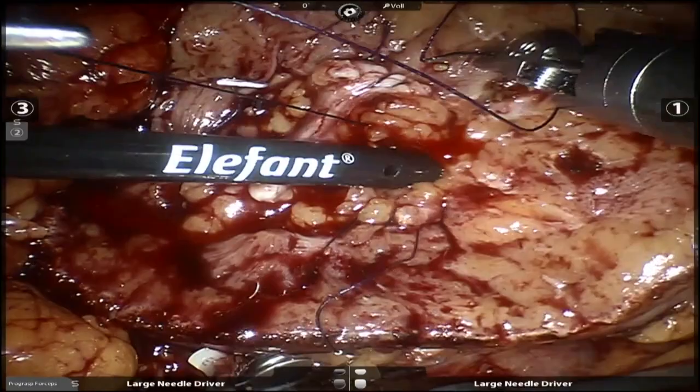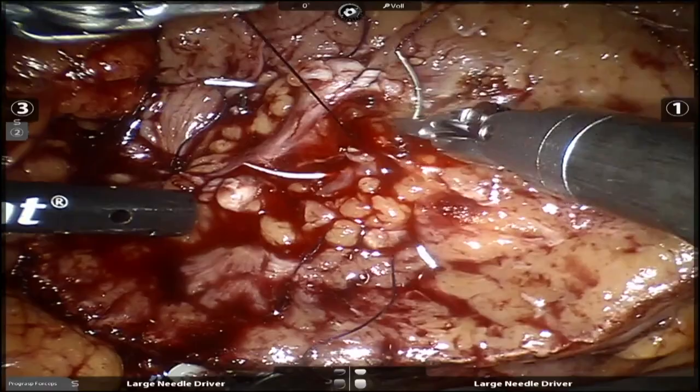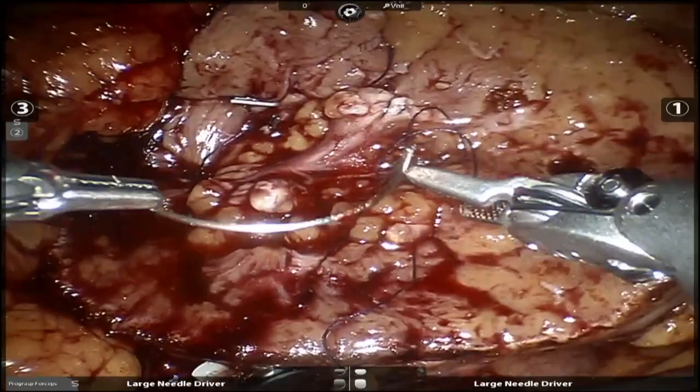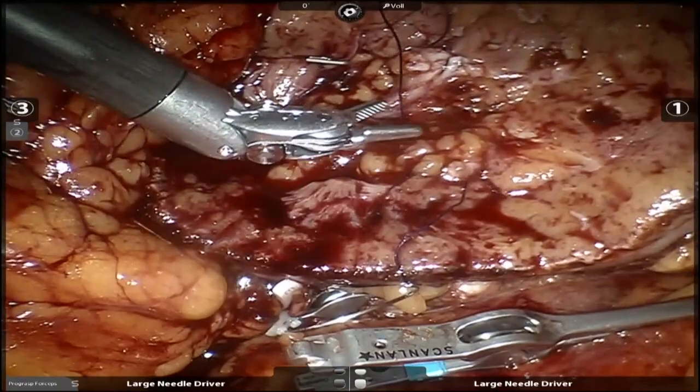There's that vein. Remember that big vein, Brandon? You want to get that vein for me? Yeah, I get it. No, I got it. I'm going right to the. This drawing with the robot looks really nice. The 20 centimeter monofilament, please. Or the PDS, whatever it is today.